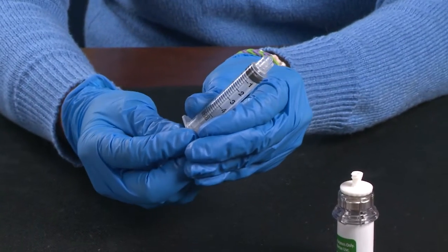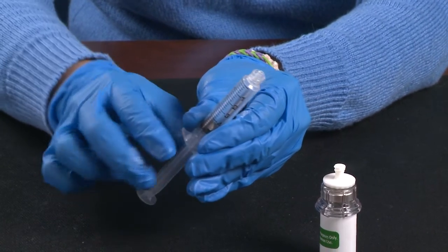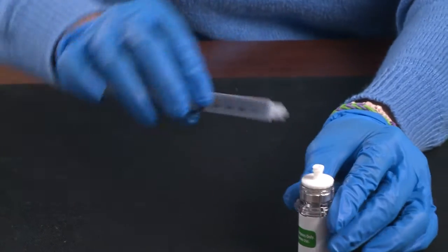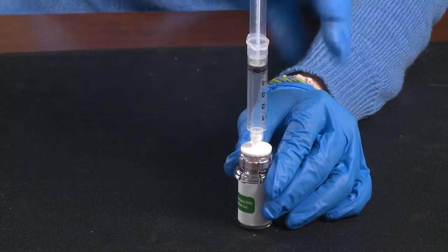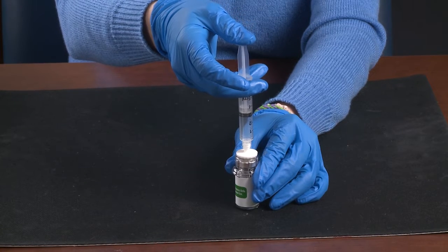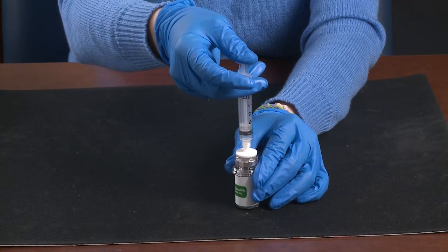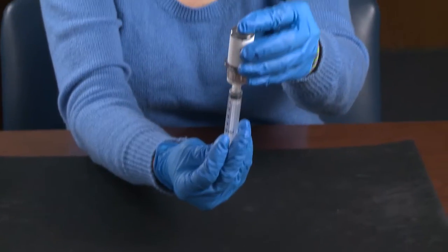Now, pull the plunger back on the syringe and attach it to the factor vial. Gently push air into the vial. Turn upside down and draw the factor into the syringe.